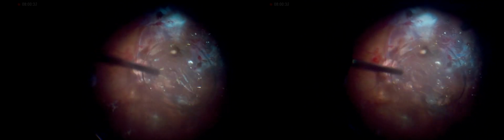Perfluorocarbon is injected back again, now to stabilize retina further, allow for endolaser and halt remaining hemorrhages. Helped by the intraocular pressure, of course, the IOP cannot be set high, in this way avoiding occlusions. And the laser is now performed in a pan-photocoagulation fashion.